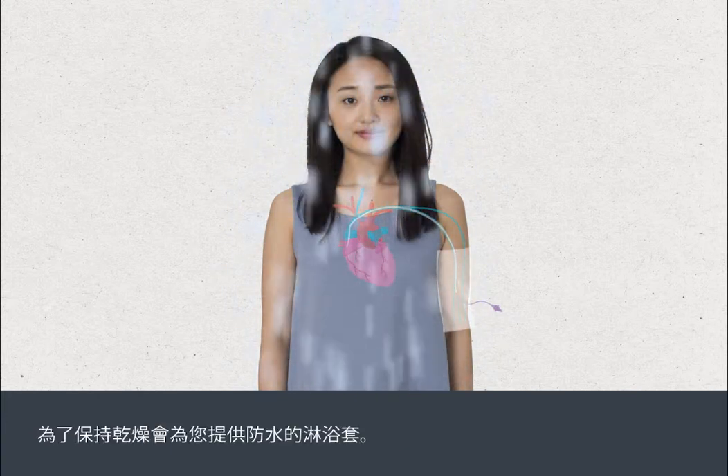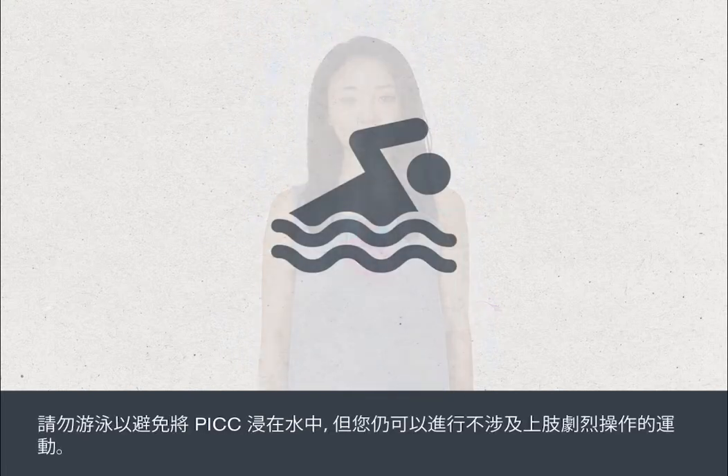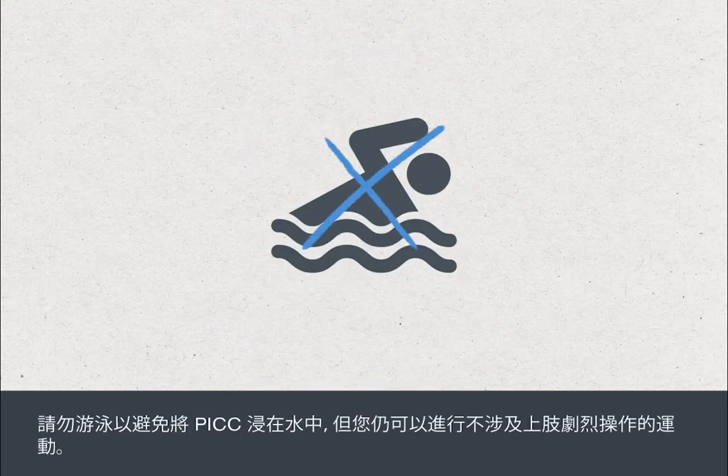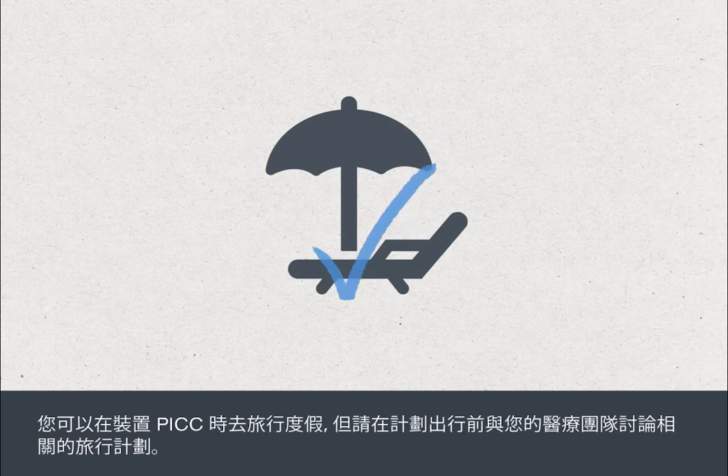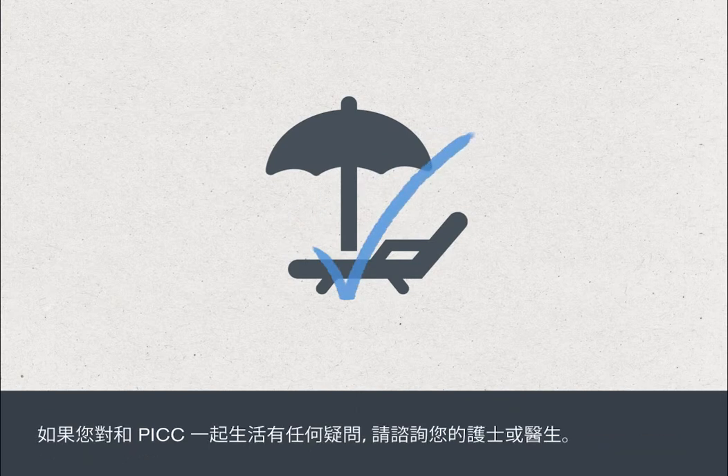Waterproof shower sleeves will be provided for this purpose. Swimming is discouraged to avoid submerging the PIC in water, but you can play most sports that don't involve excessive upper body movement. You can go on holiday with a PIC in place, but it's a good idea to discuss holiday plans with your medical team. If you have any doubts about living with your PIC, just ask your nurse or doctor for advice.